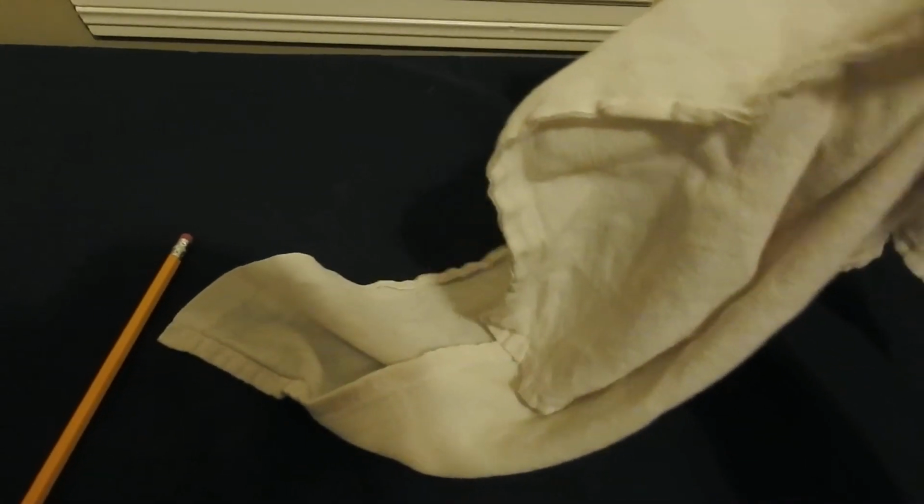Next, now that we have the splint in place, the proper method of applying an arm sling and swathe for the arm injury. If you do not have a triangular bandage, improvise with such things as a sheet, in this case for me a towel, a large scarf, a jacket, etc. You can use a small blanket if you want, just as long as it's applicable for an arm injury.